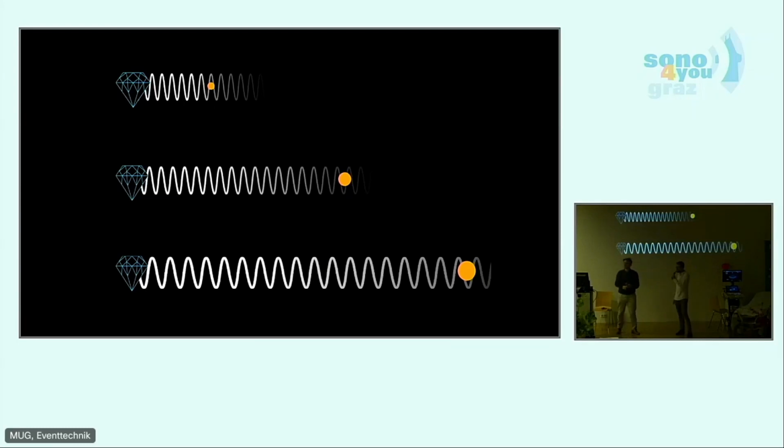Everything. Because as you want to penetrate the walls deeper with lower frequencies, we do the same in ultrasound. We use different frequencies. So as you see in this image, if we use a very low frequency, we would penetrate deeply into the tissue and get a huge picture. And if you take a higher frequency, we would not penetrate very well. And so maybe at that point you may ask, why use a high frequency? We need it because it's not just absorbed stronger, it also gives more detailed reflections of smaller structures. And by that, it gives us a higher resolution.